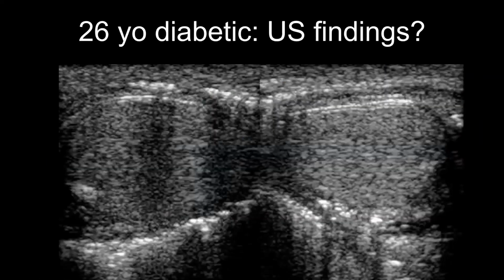Moving on to another category. This is a patient that I remember well, a 26-year-old diabetic, and it was early in the morning. I wasn't on ultrasound, but I was walking down the hallway and one of our sonographers came out and got me and said, hey, I really need some help with this. Can you come in and help me?